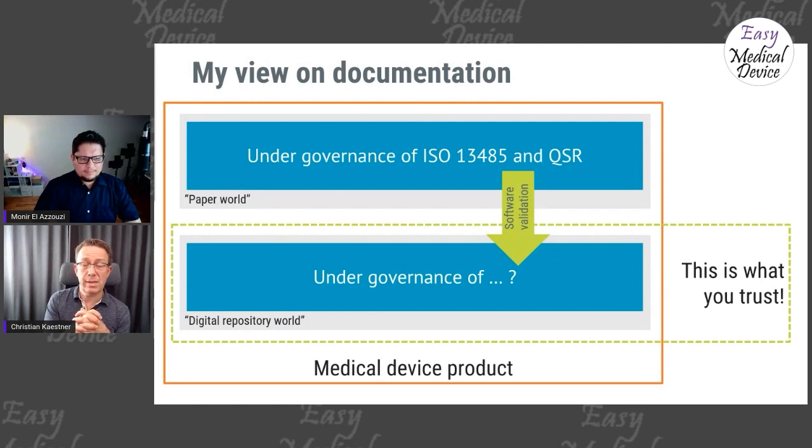Well, IEC 62304 talks about configuration management. And this is where the ways you control and manage your source code come in. So that's where you look at configuration items. What do you need to put under control? But it doesn't describe how you store those kinds of things. No, it doesn't describe. It's up to each manufacturer to define how you want to store it.